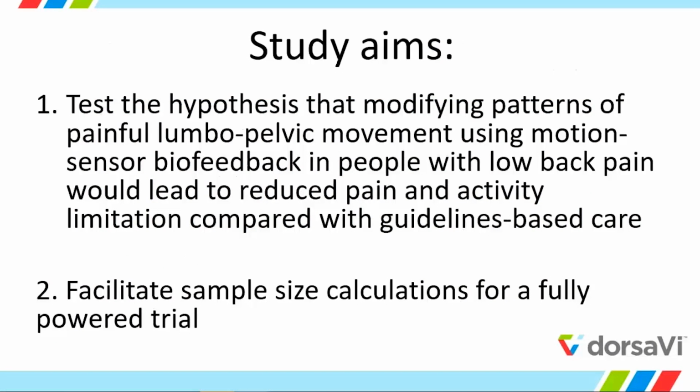The hypothesis that they had was that modifying patterns of your painful lumbopelvic movement using the sensors in people with low back pain would result in reduced pain and activity limitations compared with a control group, in inverted commas, who just had guidelines-based care. Guidelines-based care was that you would treat them within the normal guidelines of the treatment of low back pain. They did not mandate what the treatment was, obviously. And there was also some goal of doing a larger study at some time.